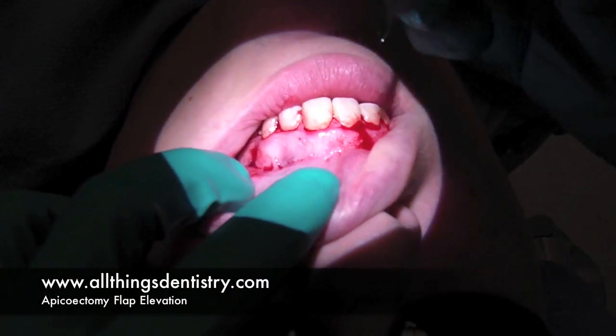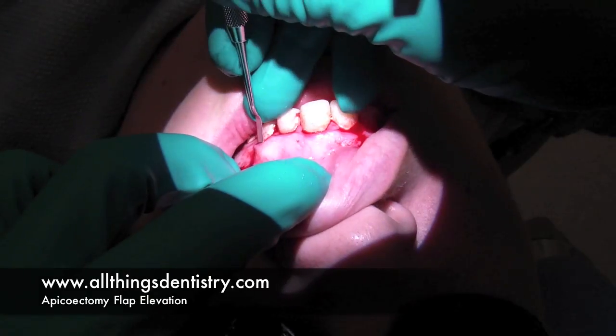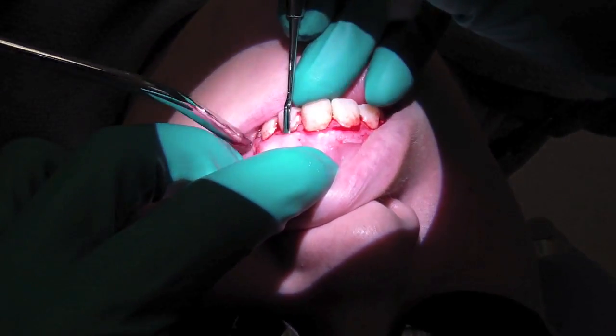Hey folks, Ashley here, AllThingsDentistry.com, and I'm just doing the voiceover for the apicoectomy. I'm running this at rabbit speed, 200%, so you're going to see the entire reflection.